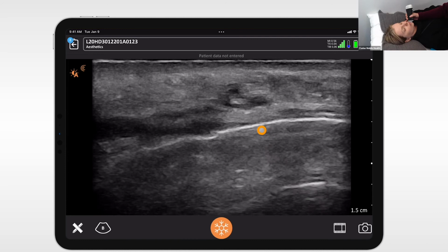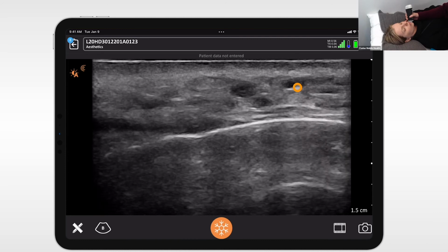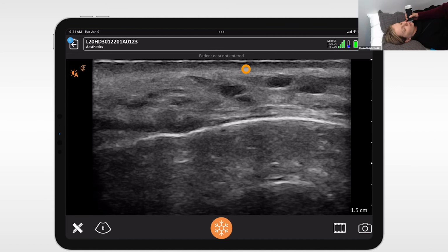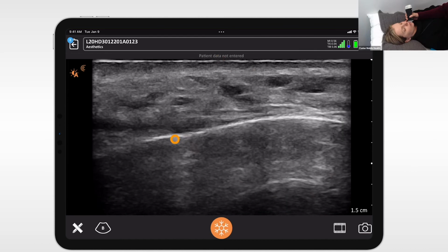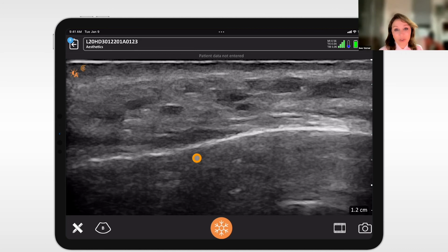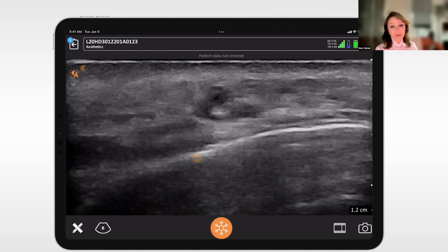And we're just seeing little pockets. She's had this filler for several months now, and it is a temporary filler, so it's not as big as it was when we first started, but we're seeing skin surface here and the filler, and this is the bone down here. I'm just going to decrease my depth a little bit to make that a little bit bigger. Yeah, you can clearly see the filler, and that's very, very nice on the scans.